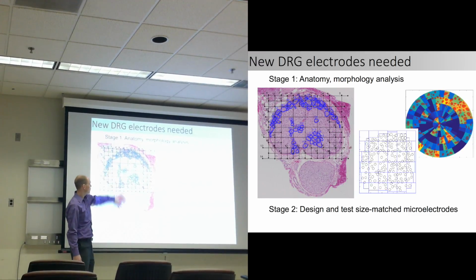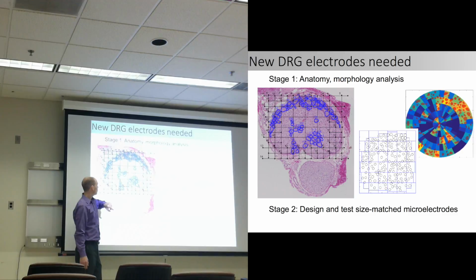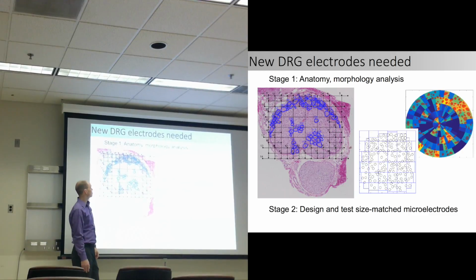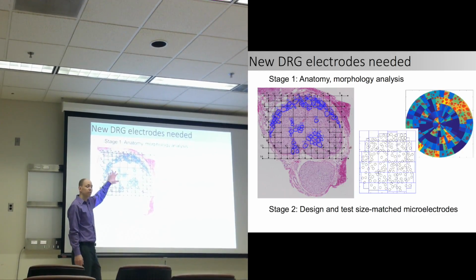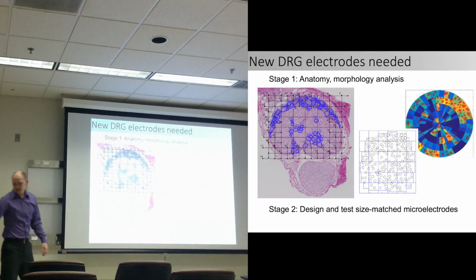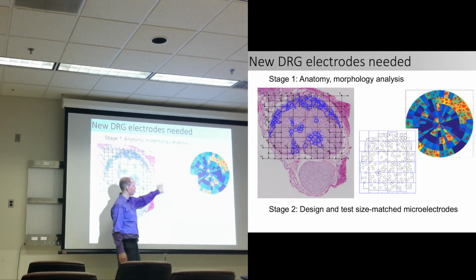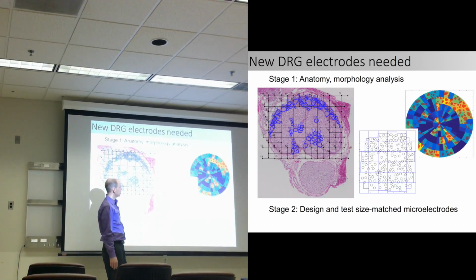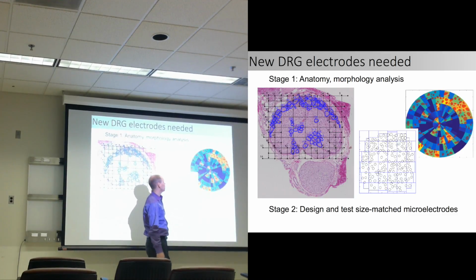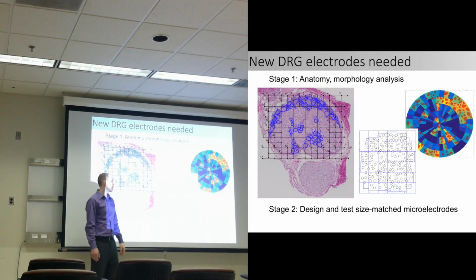So here's a cross section of the lumbar spinal nerve. Dorsal ganglion at the top, spinal nerve eventually, and axons at the bottom. And in this case, all of these cell bodies are circled in blue. I get an idea of where they're distributed because if you have electrodes near them, they have a larger action potential than you can see in the axons. And a couple of students in the lab are working on different ways of quantifying cell body distribution across a range of different samples as well. So in general, it's starting to look like, as has been mentioned qualitatively elsewhere, that there are a lot of cell bodies on the surface of the ganglion.